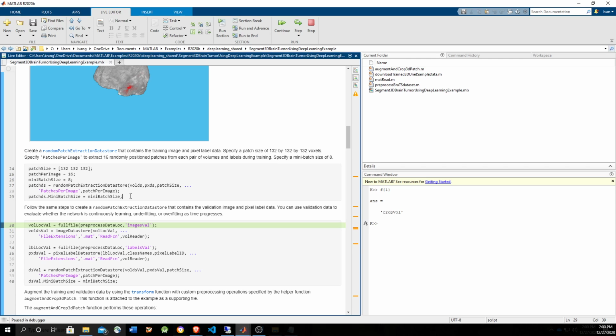Regularization strategies can include using rectified linear unit layers, dropout layers, other things, doing some trick with the data. So there are various ways to regularize and to avoid that your model overfits in order to generalize well. So that's why you need to provide a validation data.